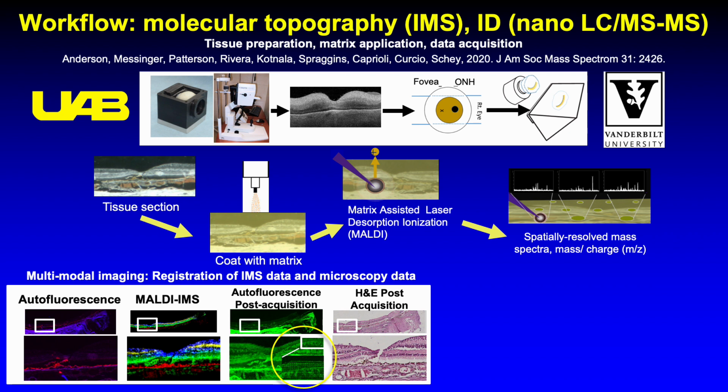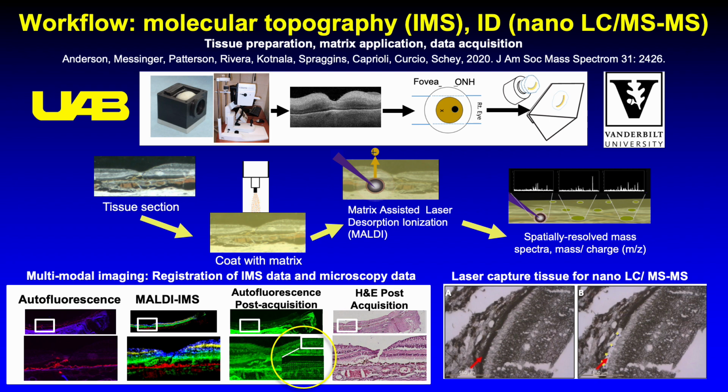With accurate mass from IMS, lipids can be identified by way of database search. Also, very tiny samples can be captured for direct assay.